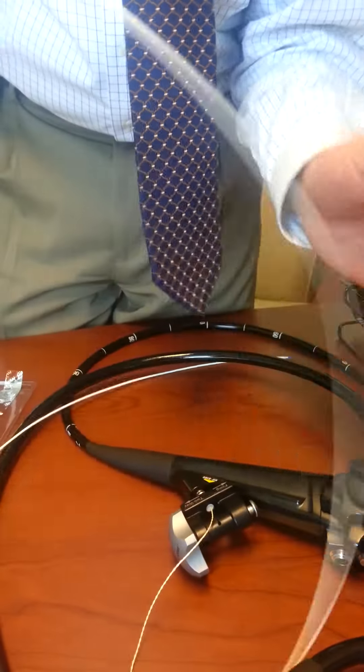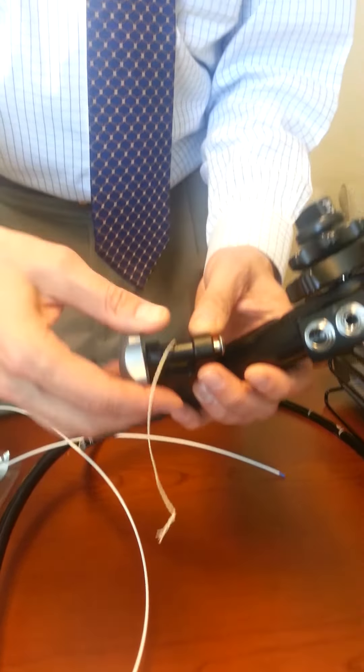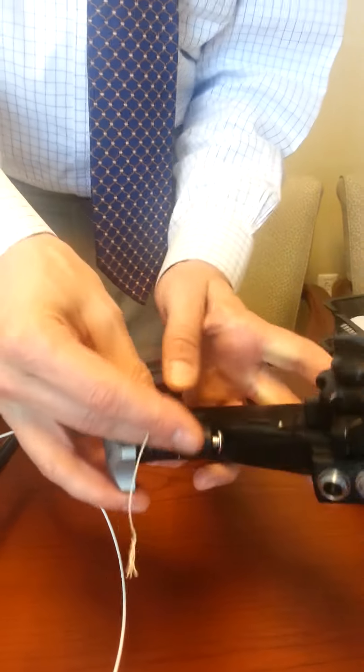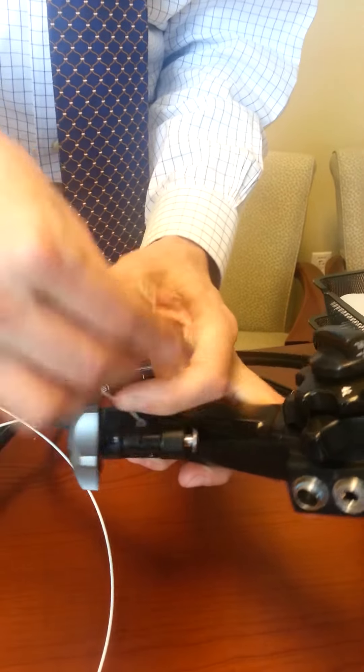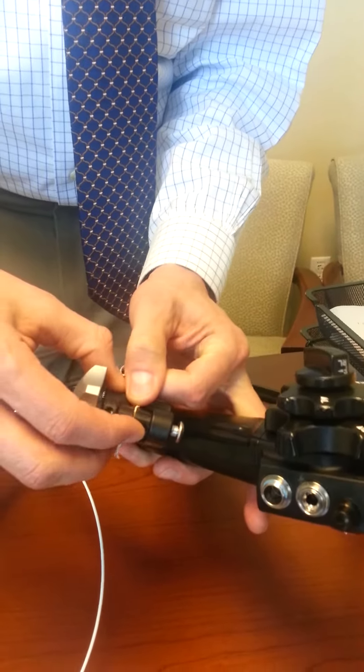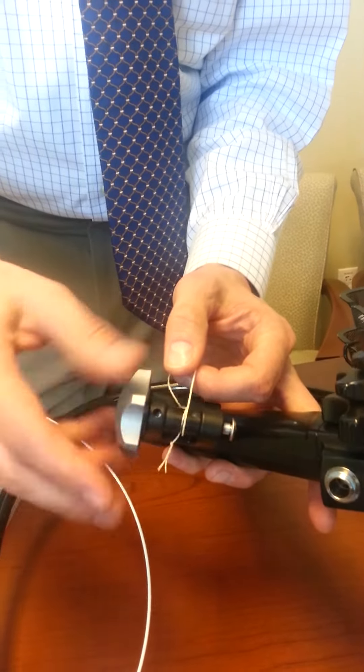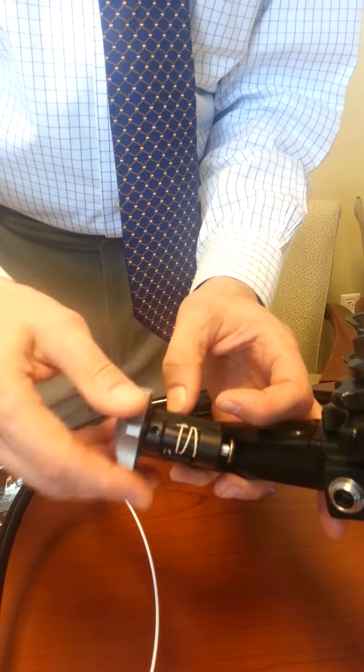The string is taken off the cannula and then hooked onto the spool. It's got a little slot in there, and then you just roll it up and you're ready to go banding.